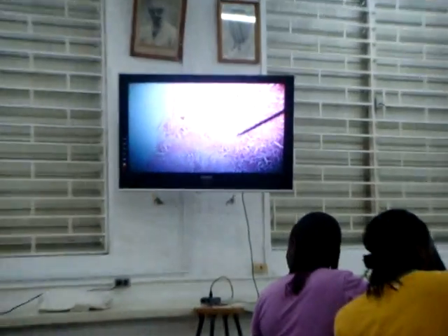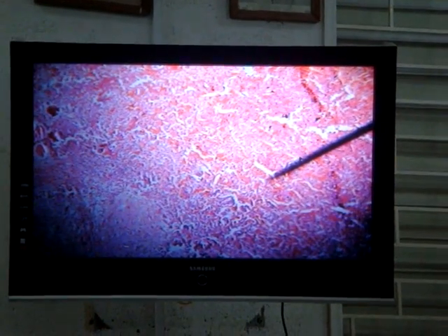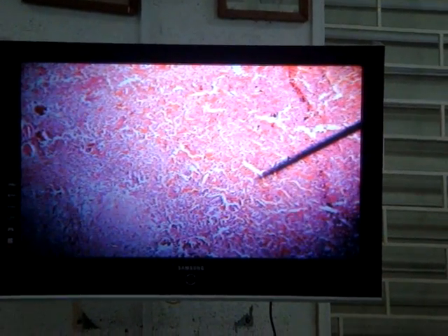The pituitary gland has a brightly stained portion. Look at that portion there. That's the adenohypophysis. It's a brightly stained part, so you can see this even with your naked eye. All of this area here, the brightly stained part, is the adenohypophysis. And then you also observe a pale portion, which is this portion here.